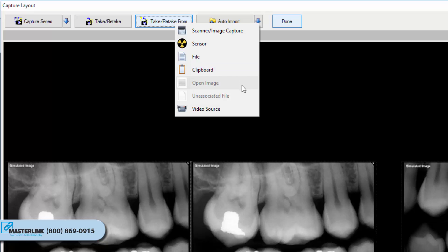Open Image: the software will prepare to acquire an image that is open on the application desktop. Unassociated File: the software will be prepared to acquire the image from unassociated files — a file not associated with the tile — contained in the current layout group. Note: the layout will display a stacked paper icon in the bottom right corner of the layout when there are images in the layout not associated with any specific tile.